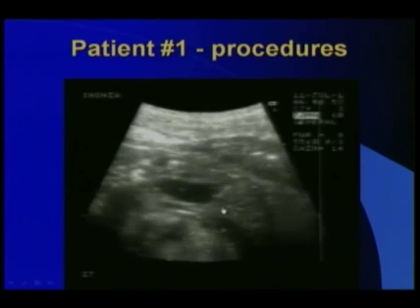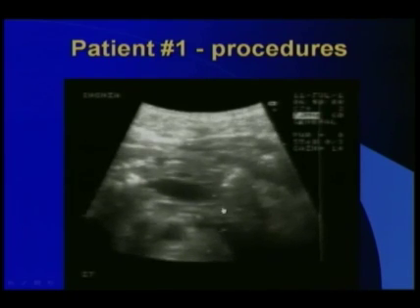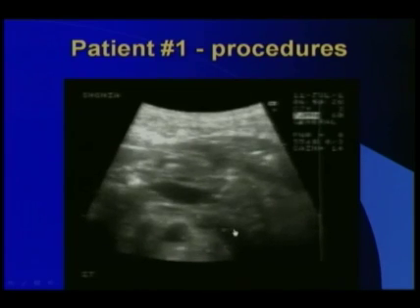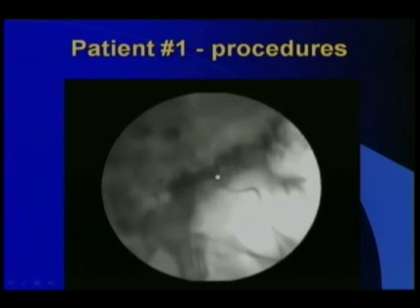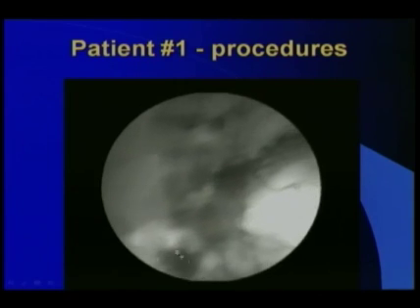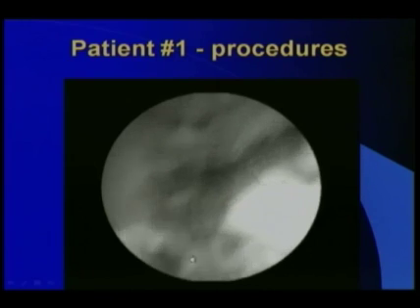It looks like it is in a Wirsung duct, but we should get pancreatic juice in it, so we are sure that we are in the correct place. Finally, we succeeded to puncture the Wirsung duct. We place the drainage catheter, and you see now fistulography. We inject the contrast, which opacifies the whole Wirsung duct, and when we create the pressure, the contrast also reaches the duodenum.